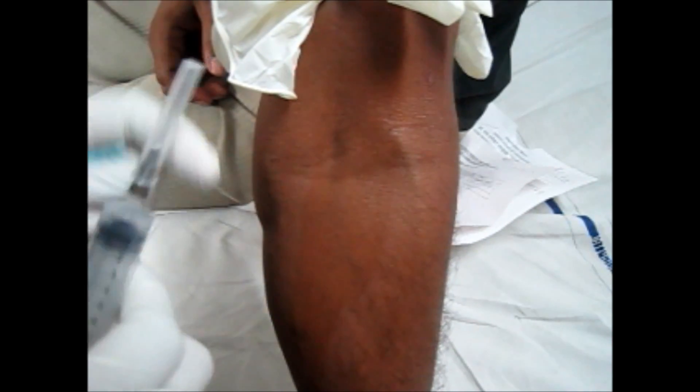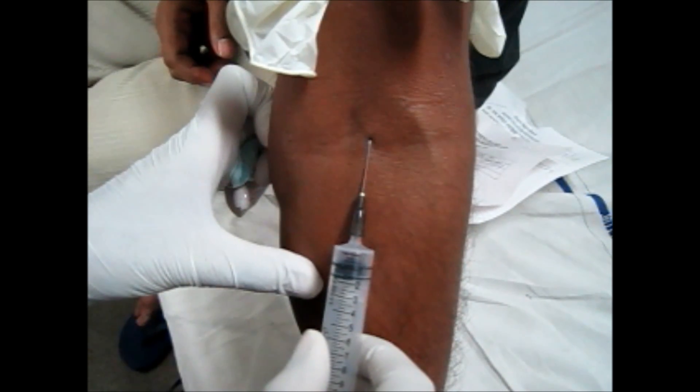After that, clean the area with the spirit swab. Now, puncture at the required place. You will see blood will come into the needle.